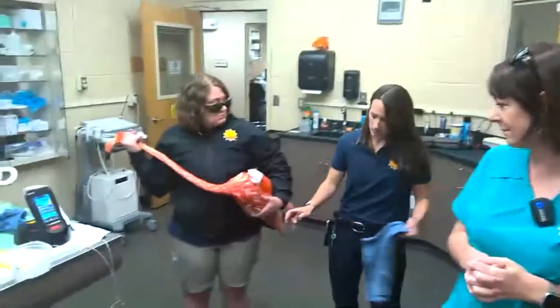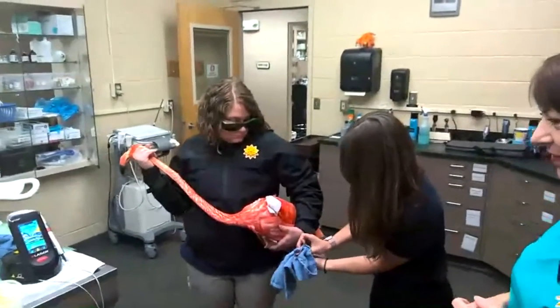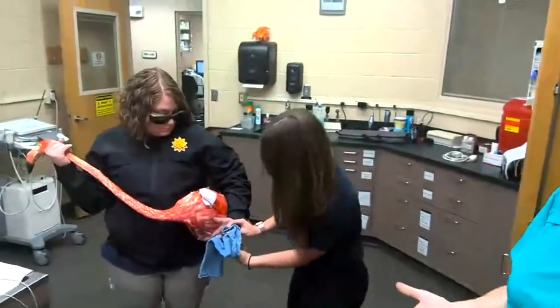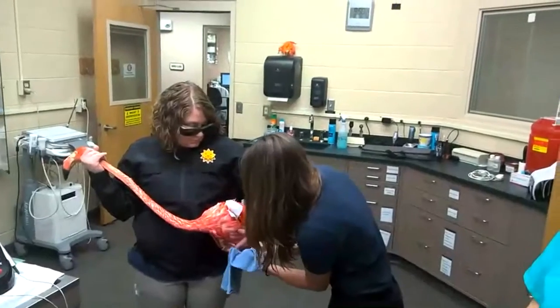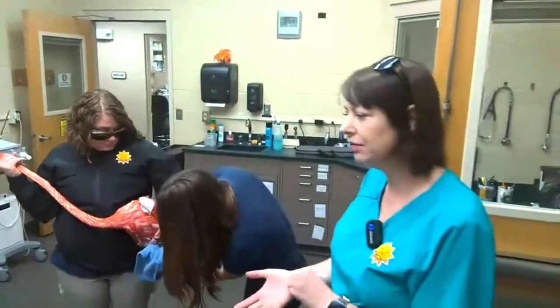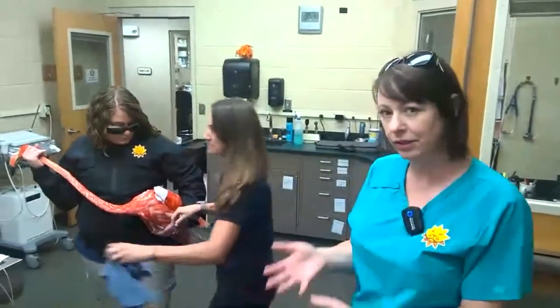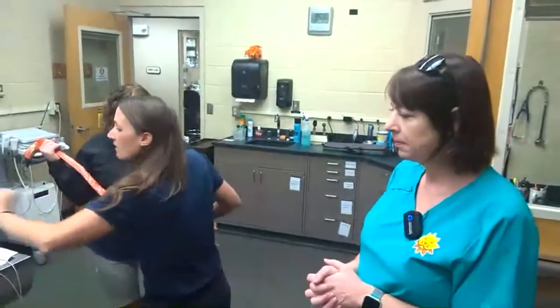And they're really curious about this laser. Can the animal feel that laser? That laser creates some heat, so they can feel the heat of the light of the laser, but beyond the warmth of the laser, they are not really feeling much else.